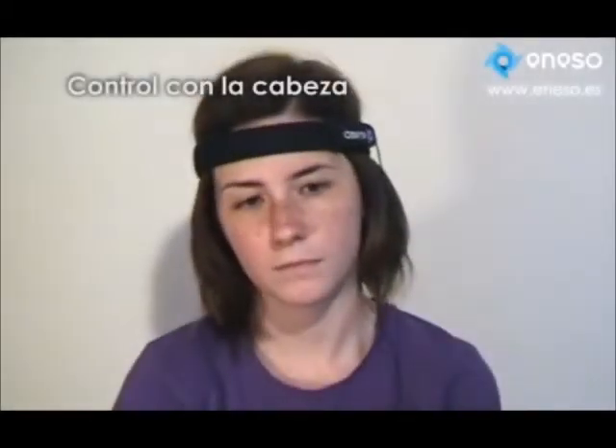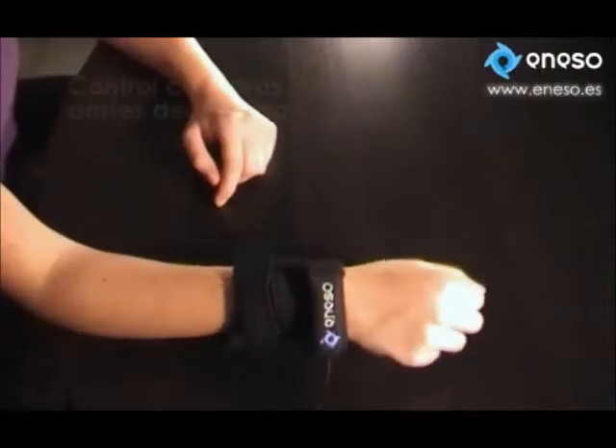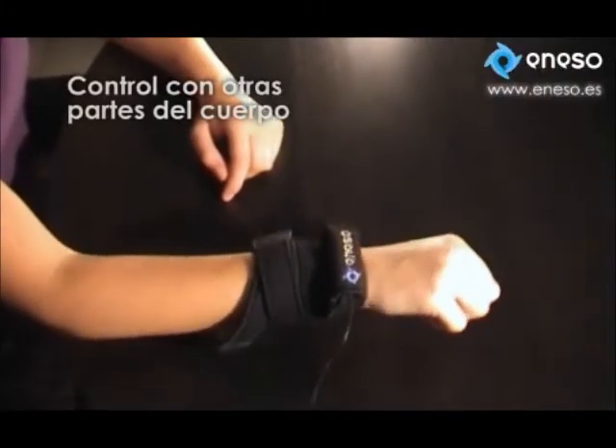The sensor unit can be attached to the head, forearm, foot, or any other body part where the user preserves some mobility.